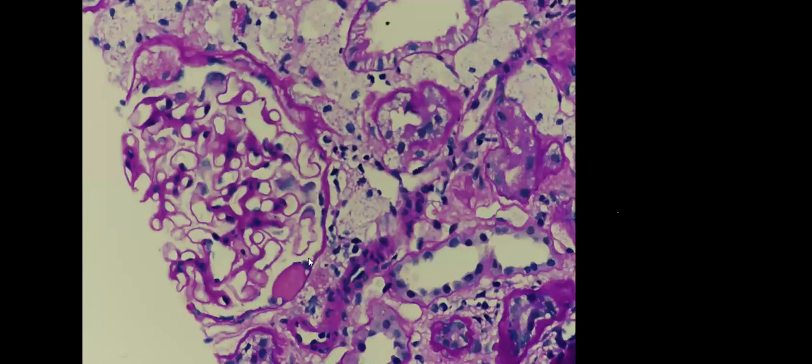Now this is a Bowman's capsule. You can see a hyalinotic lesion just attached to the Bowman's capsule, inside part of the Bowman's capsule. This is called a capsular drop. Okay, there is some thickening of the membrane.